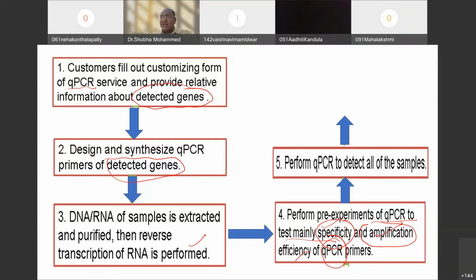How will the quality analysis be done? For example, we have a machine called an auto analyzer, and we have an ELISA and CLIA model. When I am running the CLIA and auto analyzer, I get a sample from another institution, not my own. I run those samples and they give me some values. I match them, and if they match, it means I am following the quality analysis and my machine is correct. Like that, we counter-check with other samples also.